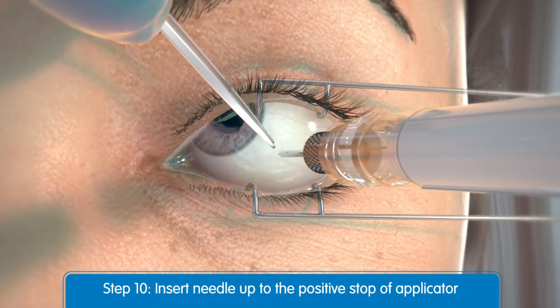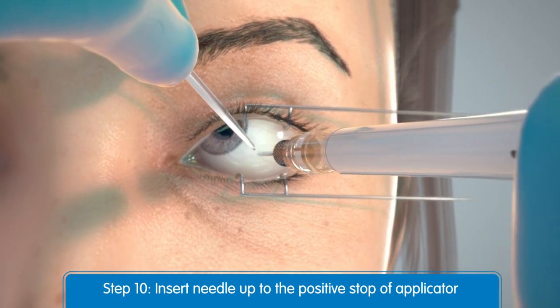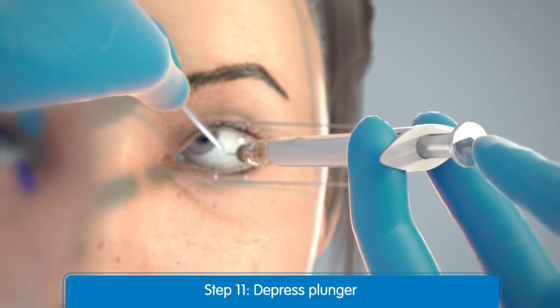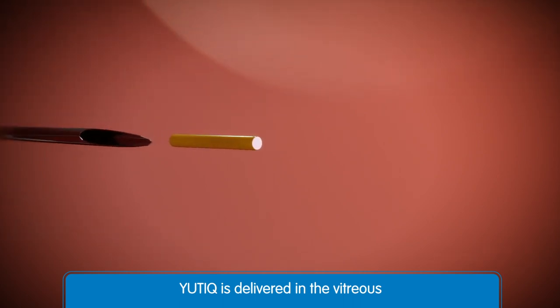Then insert the needle through the conjunctiva and sclera up to the positive stop of the applicator. Once the needle is fully inserted, depress the plunger at the back of the applicator. From inside the eye, you can see the delivery of the Utique implant into the posterior segment of the eye.